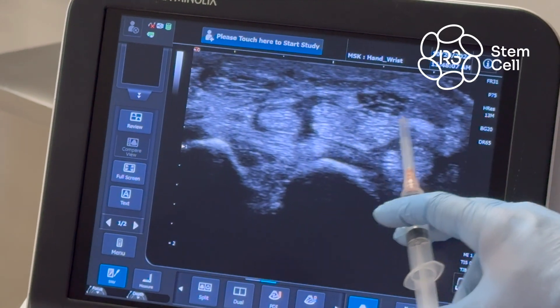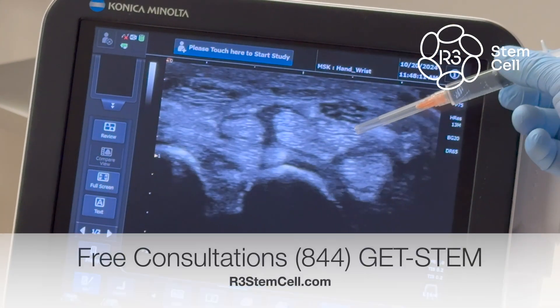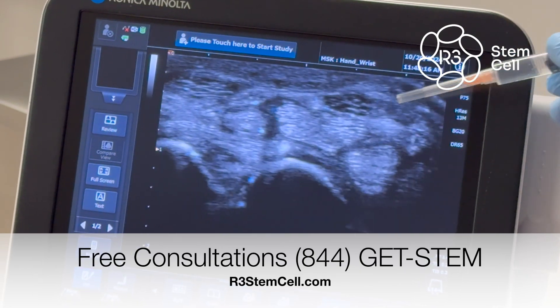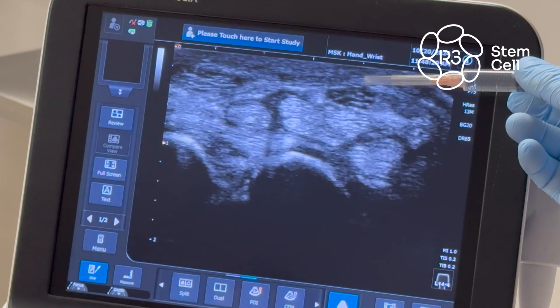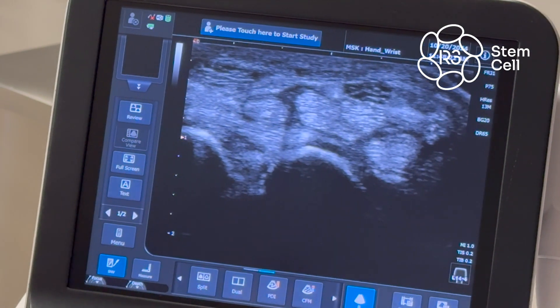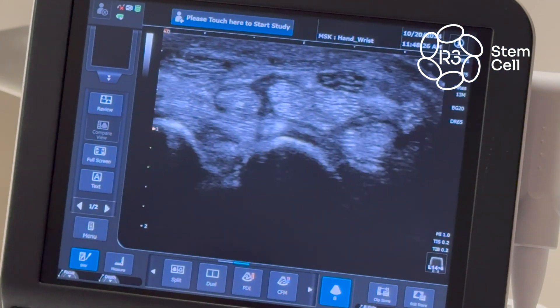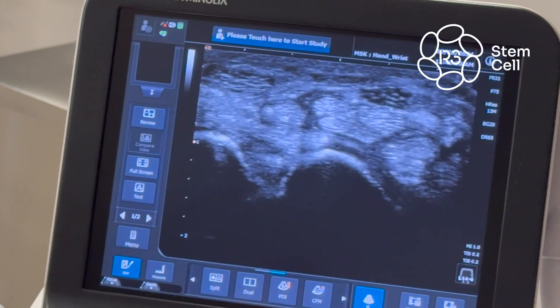This is the median nerve. What we're going to do is a nerve hydrodissection. We're going to bring the needle underneath here, put two cc's of exosomes and saline underneath, come back, flatten it off, and come across the top and put two cc's of exosomes and saline above it. That will untrap it from being caught in the carpal tunnel. He has symptoms of numbness in his thumb and forefinger.